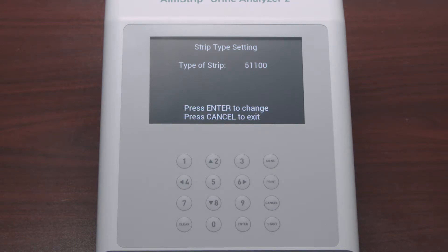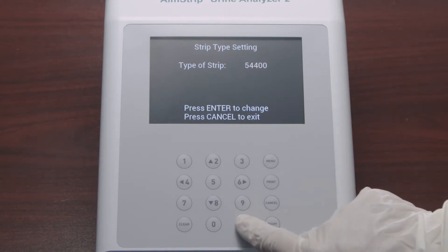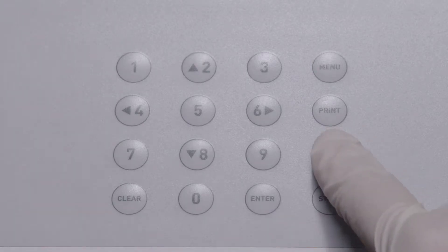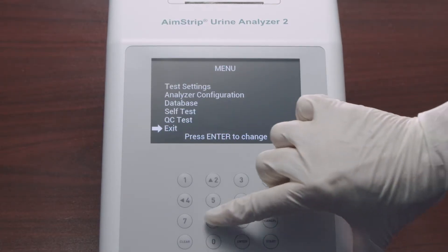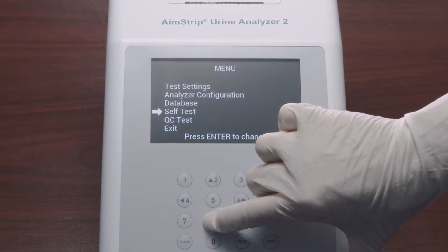If the strip type on the screen is not the strip type you intend to run, press the Enter key to cycle through the available strip types until you reach the one you need. Once the desired strip type is shown, press Cancel to reach the initial screen. Press Menu from the initial screen to access the test settings, analyzer configuration, and QC test.